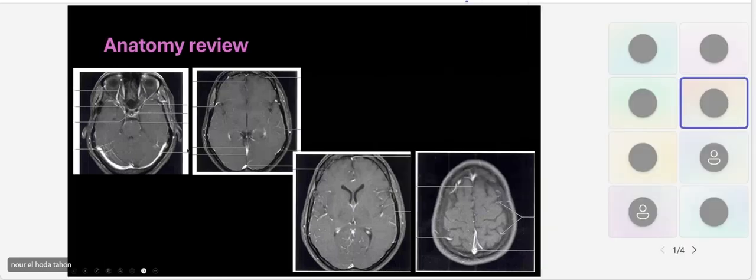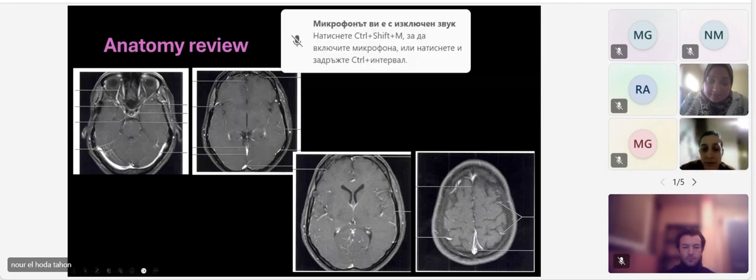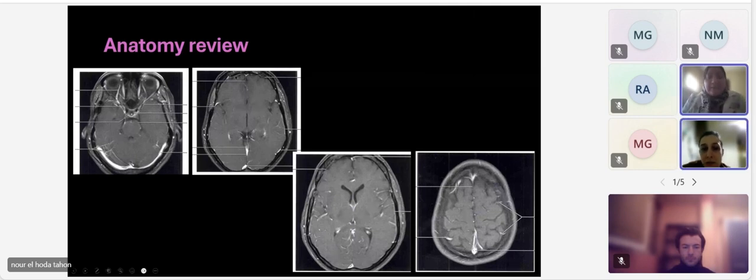Okay, so this is a post contrast because of what? Because I can see the sinuses are bright and full of contrast. Yes, exactly. And if you remember, we talked about these blood vessels in T2, when we talked about flow void, they were dark, right? In T1, maybe we couldn't appreciate it, but now the patient has contrast. The patient got contrast after the T1.